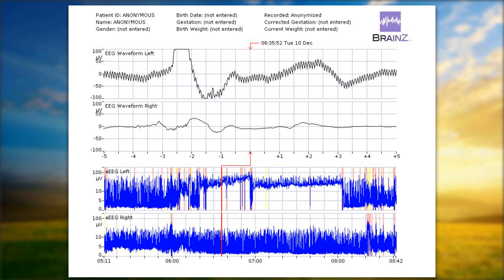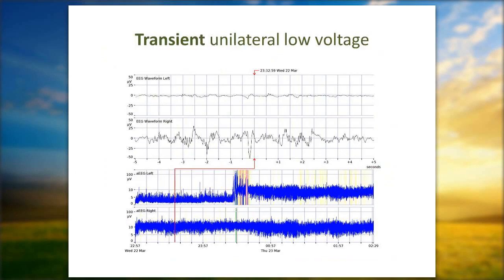And then around 8 o'clock, about a 2-hour bit, either someone did something to relocate the electrodes or they repositioned the baby again, which wouldn't be too unusual for an every 2-hour position change. That movement back at 8 o'clock actually created a change to the interference that we have, and then we're back to a pretty much burst suppression looking pattern at that point. So sometimes we see this alternating asymmetry from position changes, and I do see this quite a fair amount.